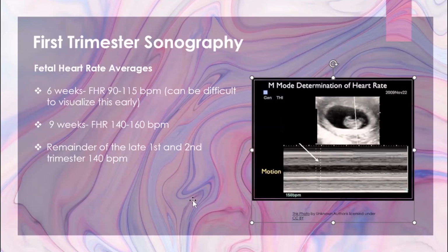that these match. The thing about measuring is you're going to use your usual caliper, but the rule of thumb is to be sure that if you put your caliper at the beginning of one heartbeat, then you're going to put the second caliper at the beginning of the next heartbeat. Or for instance, if you put the first caliper at the end of a heartbeat, make sure that the very next one you put the caliper at the end. Wherever you put the caliper is your decision. Just make sure that you do it exactly the same on the next heartbeat to get an accurate measurement.